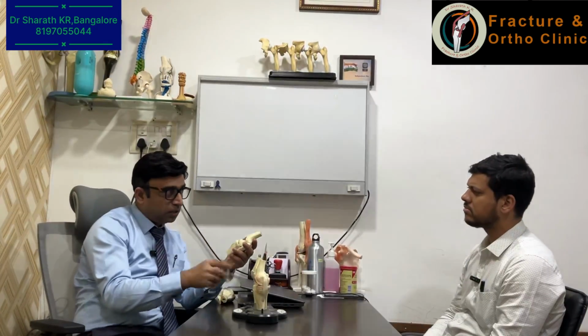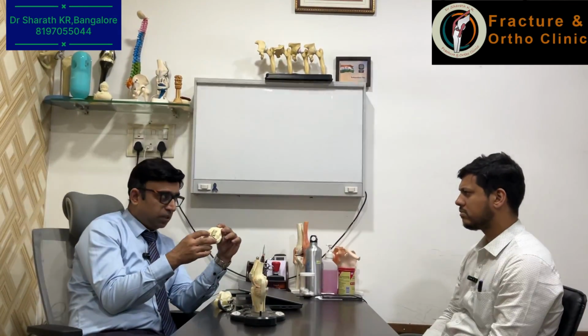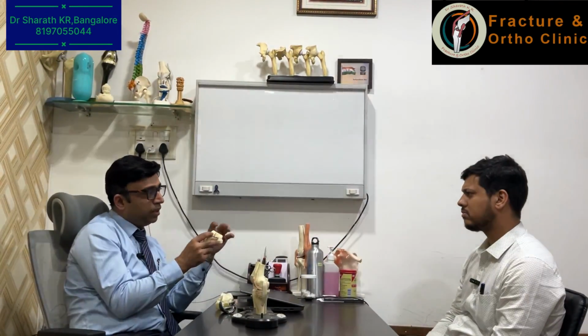During this resection, we look into a few finer aspects, like at what angle this bone has to be resected, in what rotation, and what thickness of bone has to be removed. These small and minor aspects, more accurate than our instruments give us, are taken from the robotic system. So this is the difference.